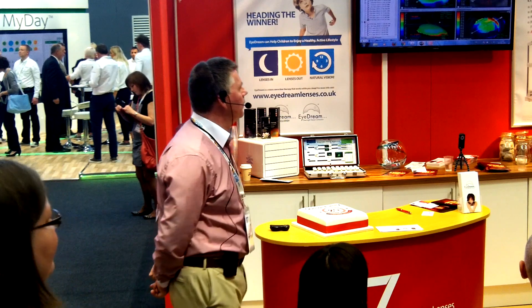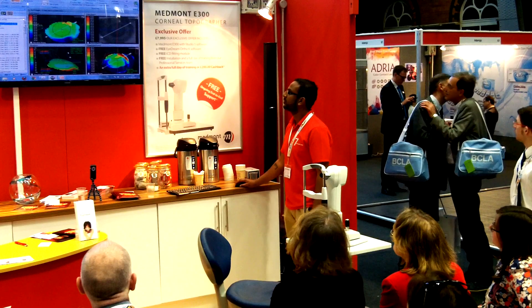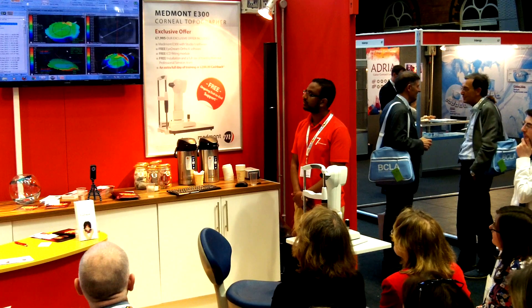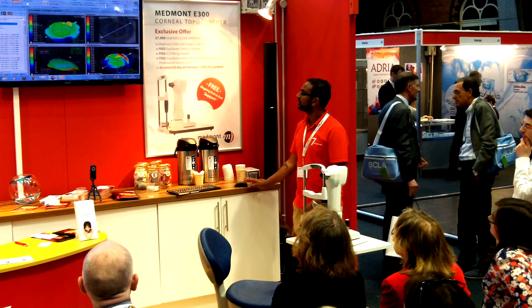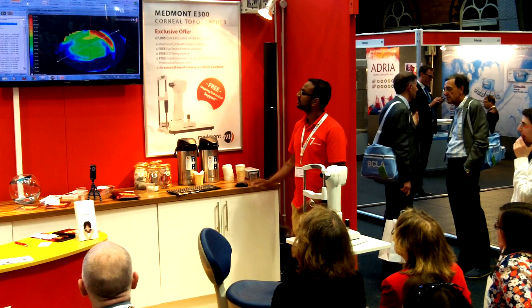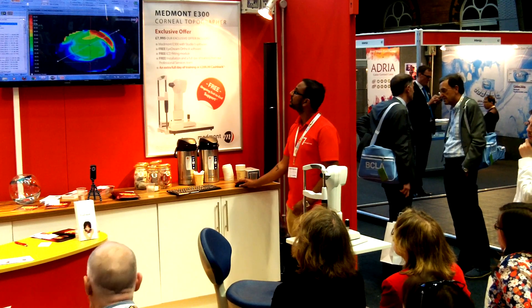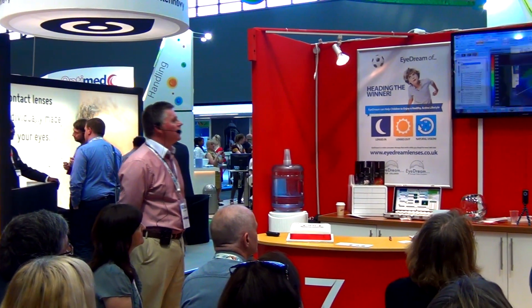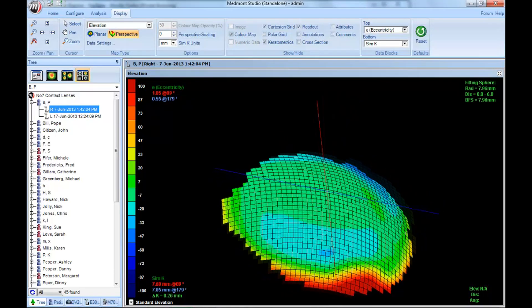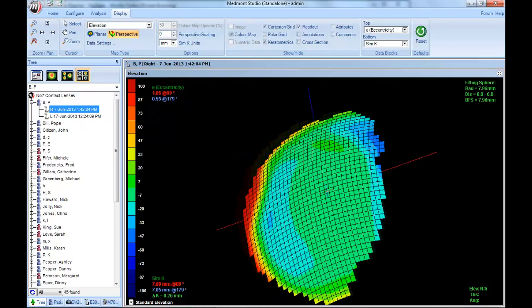Can we do different types of imagery? We've got four different images there. We've got the original mires, we've got an axial image which gives a very broad, generalistic viewpoint of the cornea, and we've got a tangential image. I tend to work with tangential all the time — I like the detail it gives me. But what I particularly like in practice is the visual aspect — the three-dimensional one, which is the one patients particularly like. And can we spin it? We rather like spinning them around, and patients like that as well.